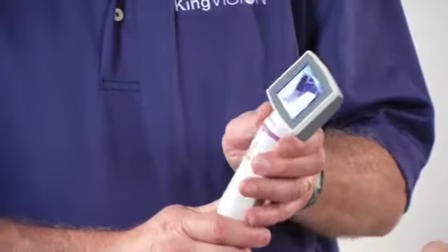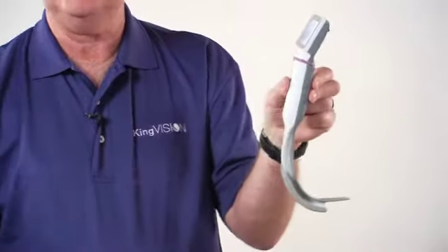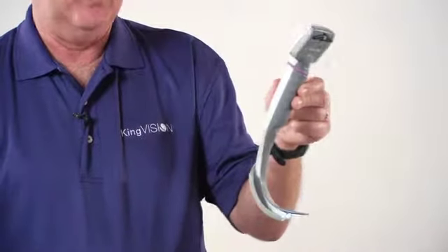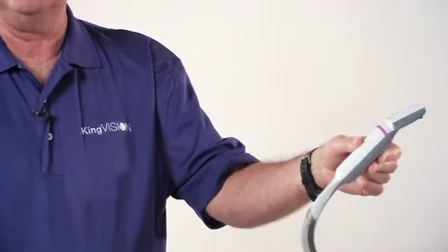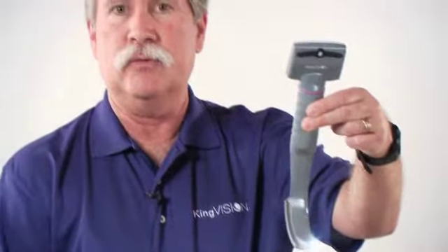Now, if you disturb this connection after it's been attached, then one of two things will happen. It will either provide a frozen image, or the screen could go blank, like that. So it's important to hold this in a way to avoid lifting on the display and disturbing this connection in use. We actually suggest that you only need to grab it with a thumb and your first two fingers. This gives you very good tactile feel as you're introducing the blade into the mouth. Also gives you very fine control if you need to manipulate it once in the mouth.